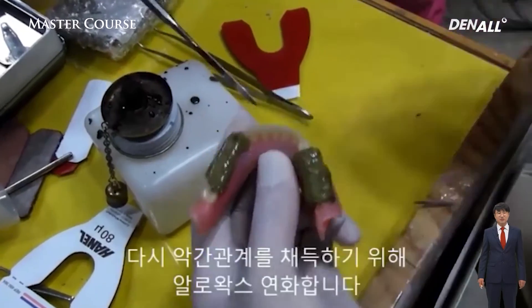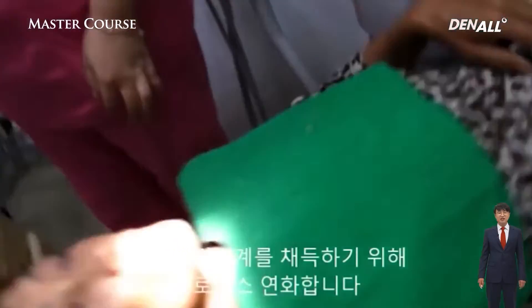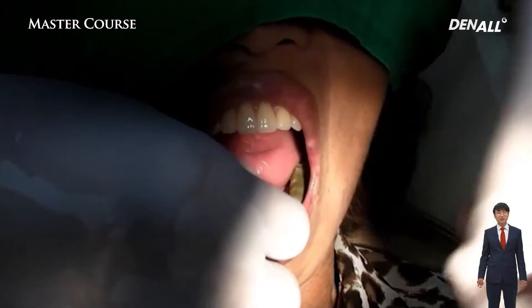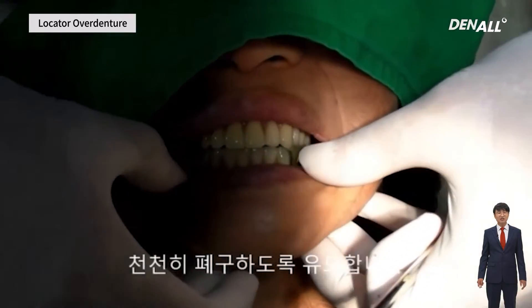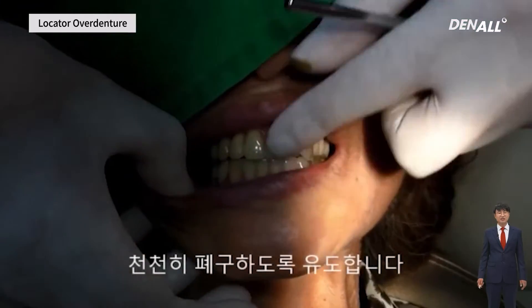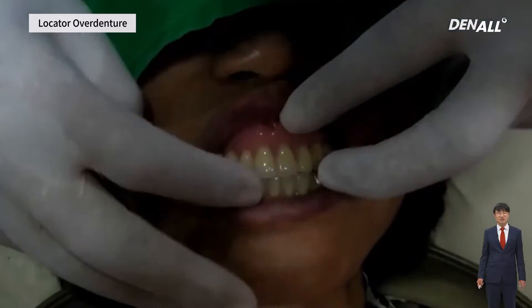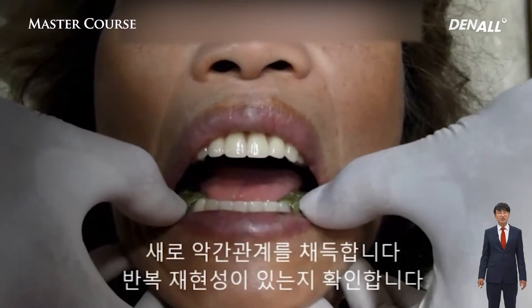Let's see how it went. With a hidden slide, making adjustments within the mouth is really challenging. To take the jaw relationships again, I usually use Aluwax — I just ask the patient to bite. I make sure that it's stable and repeatable.